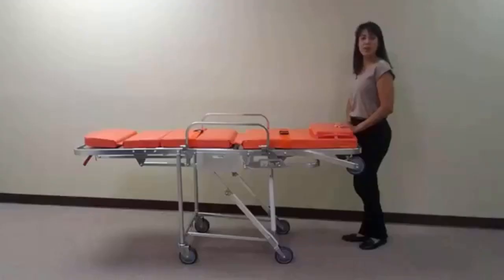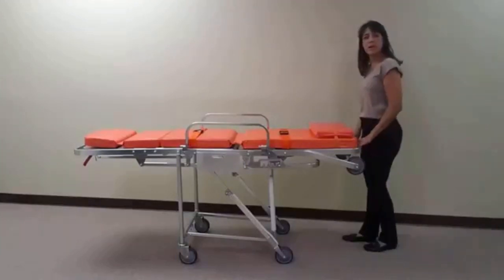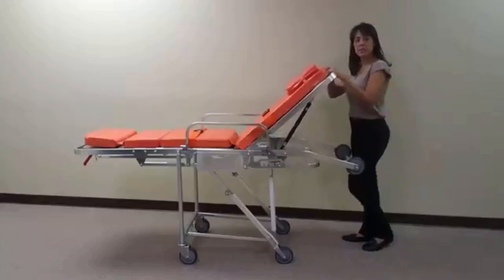The MS3C1000 has a fully adjustable backrest. To adjust the backrest, squeeze the red lever and slowly adjust the backrest to the desired position.